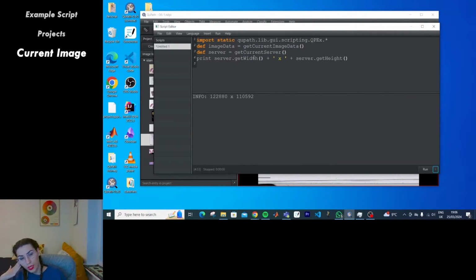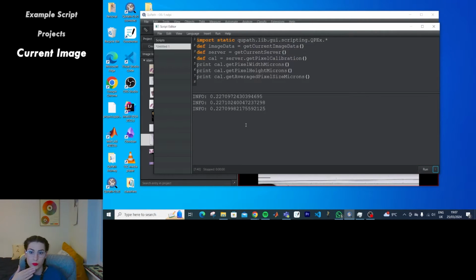But how do I know which things I can use? There is no way to evaluate the variables or anything. Now here is where I start getting frustrated because I'm very used to being able to see the variables, and now I can't, and I don't know what things inside of the server I could see. So I just keep trying.